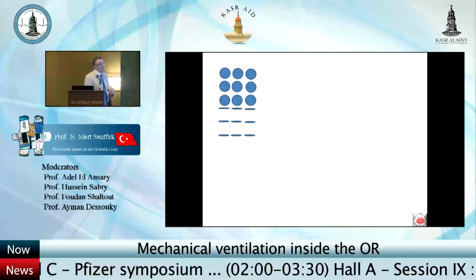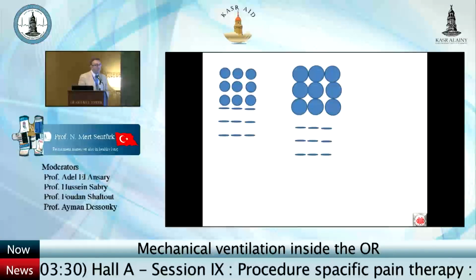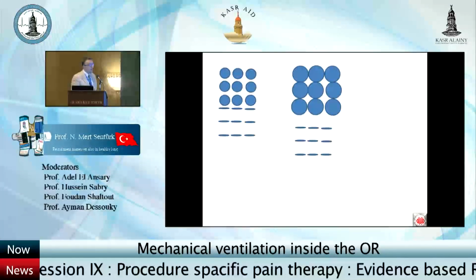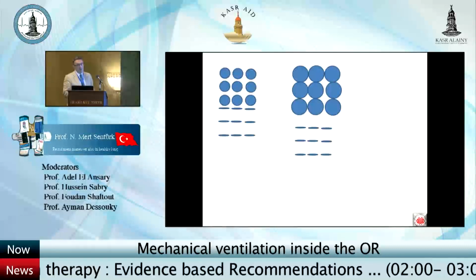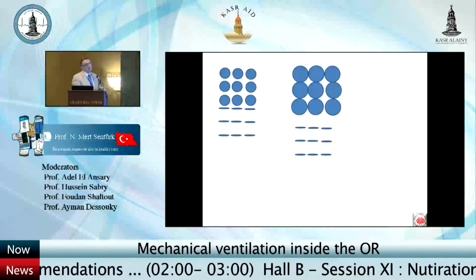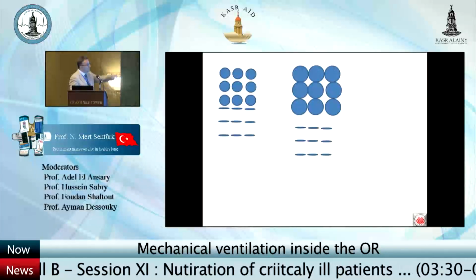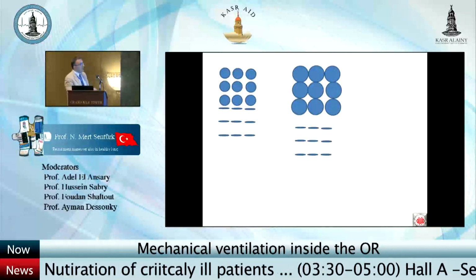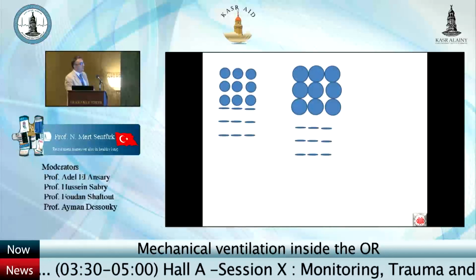If I apply only some PEEP to these alveoli, this would be the result, unfortunately. You cannot open the already collapsed alveoli with PEEP alone. The PEEP that you apply goes directly to the alveoli which are already open. This is not good for the closed alveoli, and it is also not good for the open alveoli because they are already over-distended.